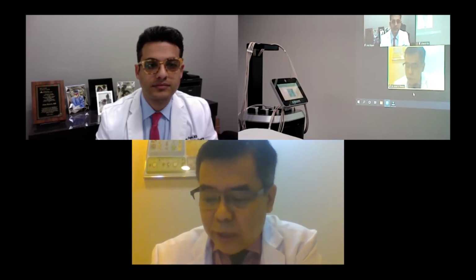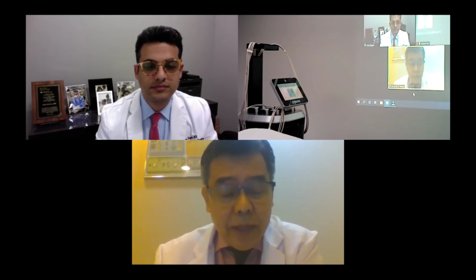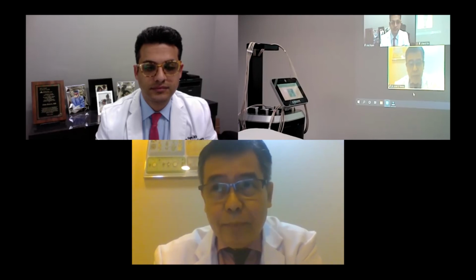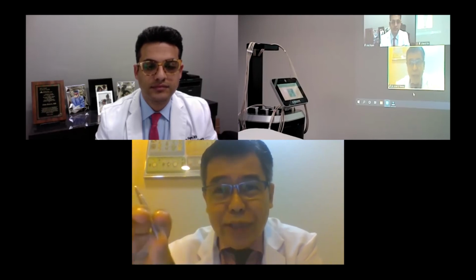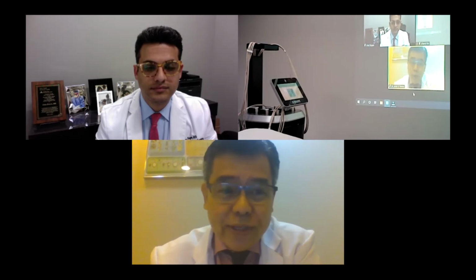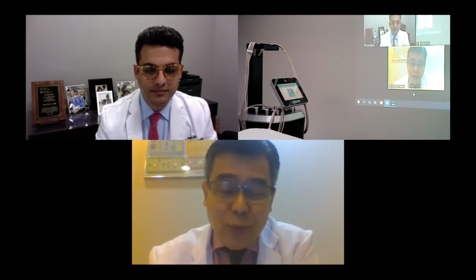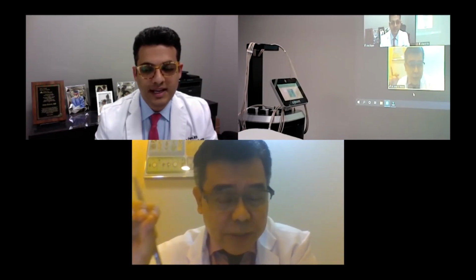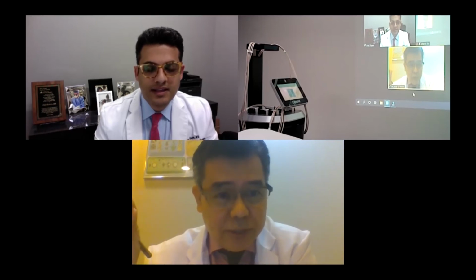You also showed the Arrhenius equation earlier regarding temperature versus time. Is there a specific threshold? It would seem that based on that equation, at any temperature, even lower, by 37 or 38, as long as you do it longer, you could reach the same net energy. However, there's a threshold. Is there a specific threshold that should be reached? Yeah, the threshold is basically 42, 43 degrees Celsius, in that ballpark.